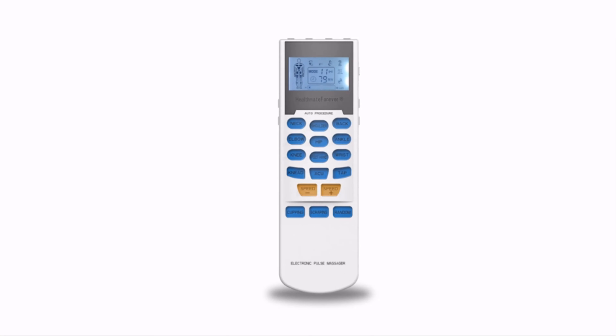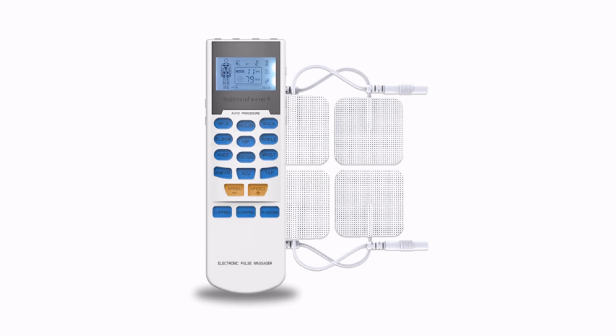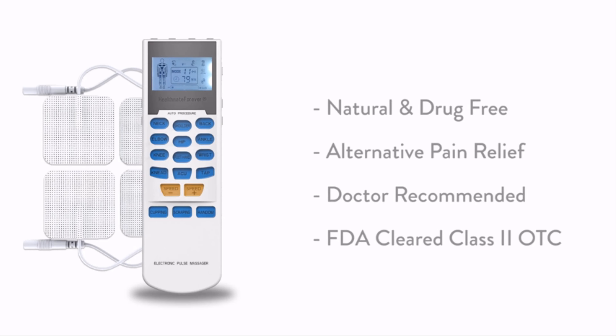The Healthmate Forever TENS therapy system has been approved as an efficient and easy way to deal with pain, with none of the side effects that come from prescription drugs. Healthmate Forever TENS therapy devices are FDA cleared, class II OTC, which means you can use them without a doctor's prescription.